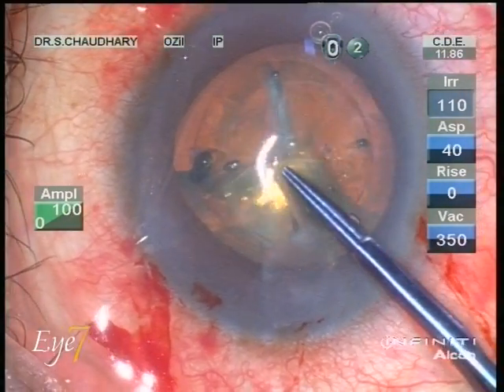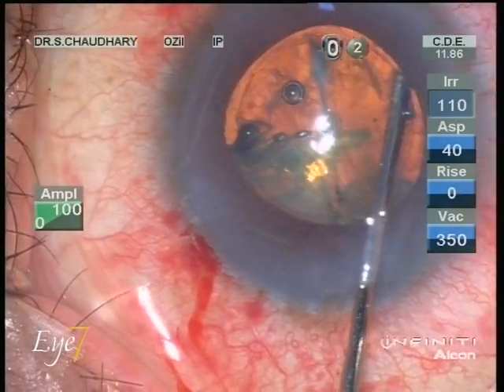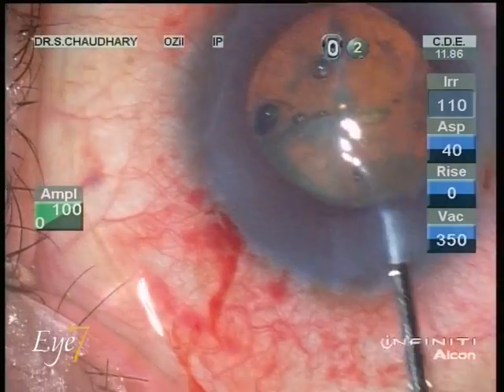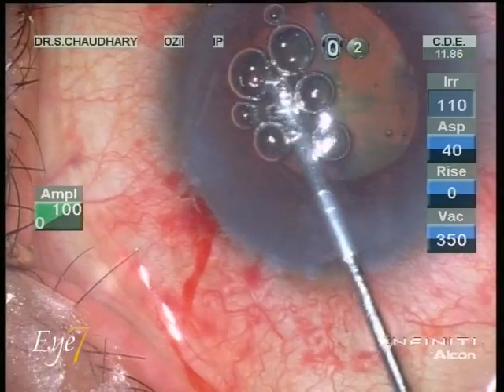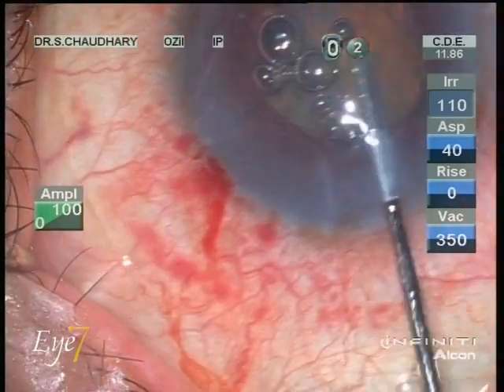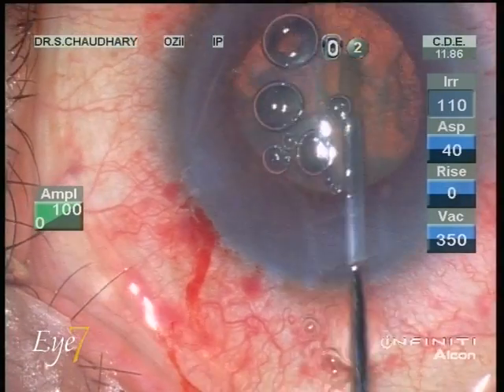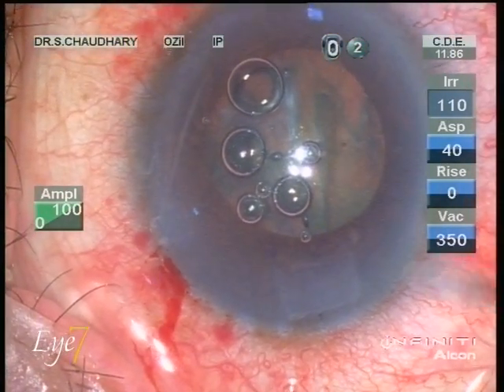We are now placing the anterior capsule on the cornea to show you the symmetry of the cut. It is a perfect round circular 5 mm diameter cut, as if it has been cut by a compass — a feature which cannot be achieved with a human hand. We do a hydrodissection and you can see these cavitation bubbles coming out, which were trapped inside the nuclear mass. Now we are ready to start the phaco.